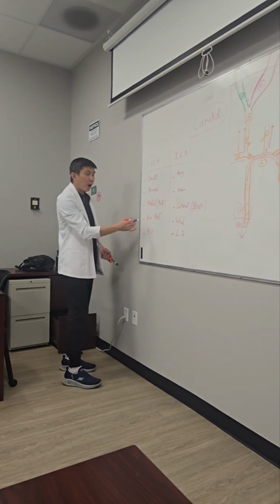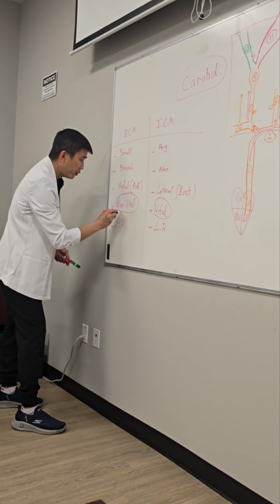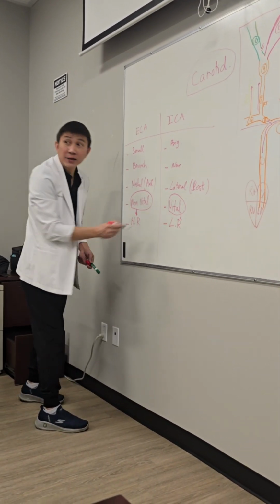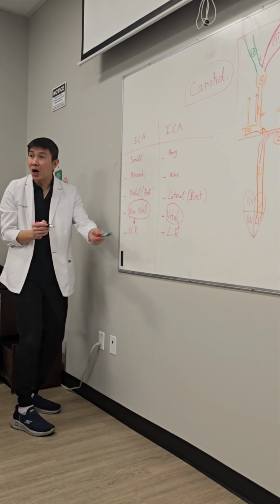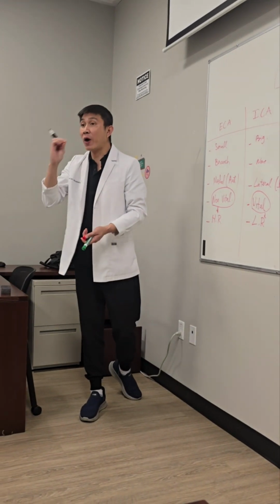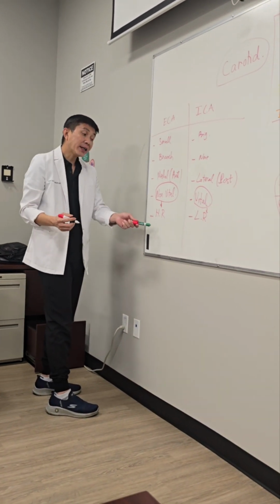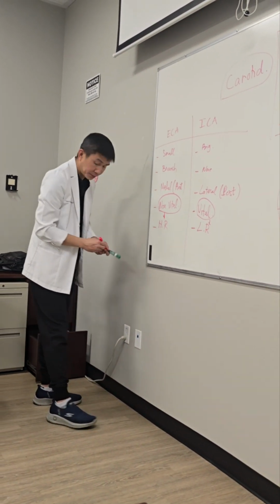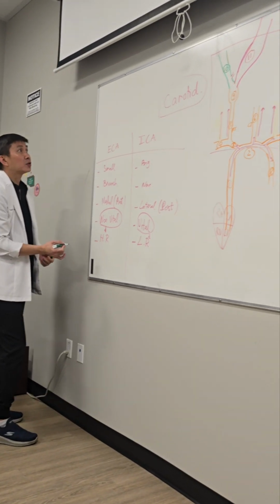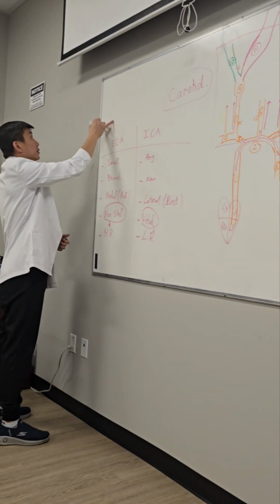So you see, from the definition here, we will define the resistance of the flow, right? And from the high and low resistance, it will define the shape of the waveform. So how does the shape of the waveform look with high resistance? I should draw it here. It's easy to see, right? So, high resistance here.